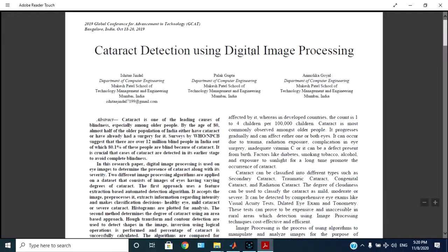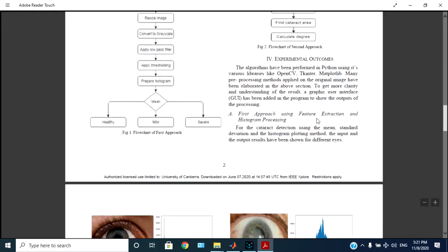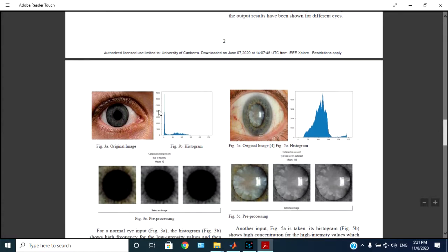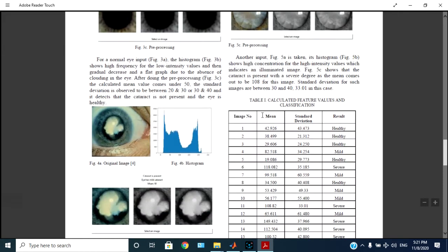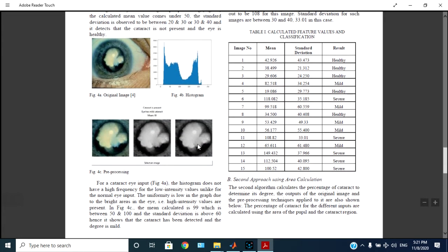Cataract detection using digital image processing. Here input eye image will be provided and from that we have to detect the eye cataract, and if it is there, like it is stage one or stage two, it will tell us.